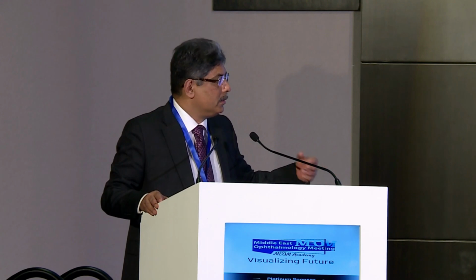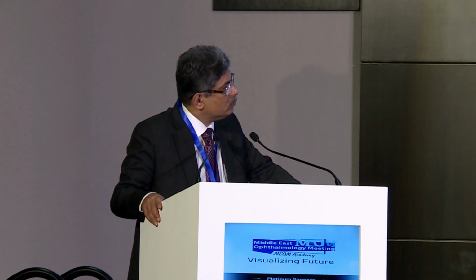No, pars plana vitrectomy has been described by Dr. Amar Vasavda, going through the pars plana route. But what I feel is we are not well versed with that, and if we do it with the anterior approach, that also works in the same way. Like I have shown in a couple of my cases, I do anterior vitrectomy through the paracentesis wound, and it should be bimanual. I agree, because recently more people are saying that you should go through the pars plicata or pars plana.